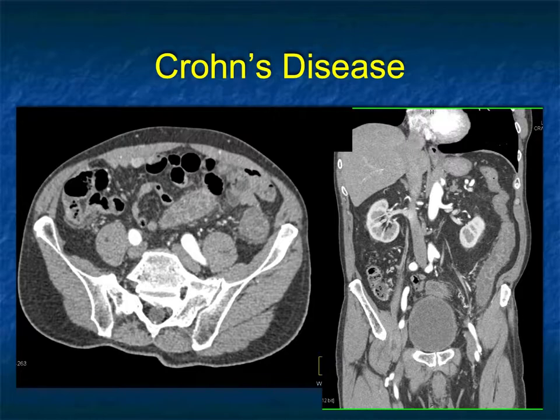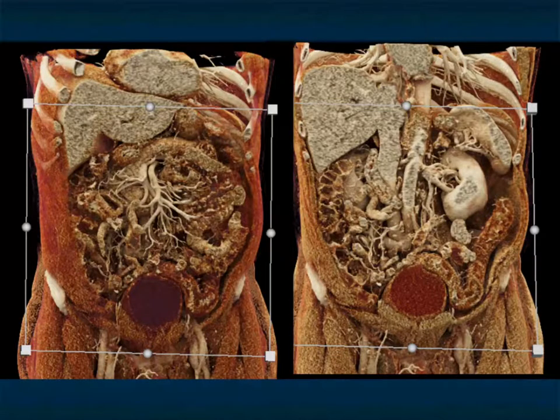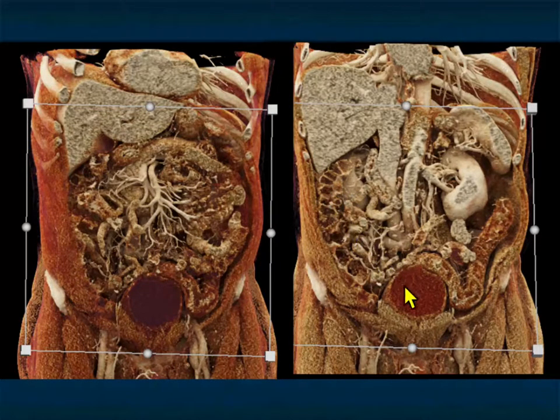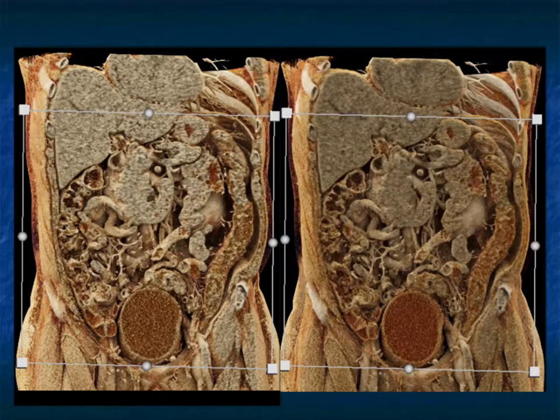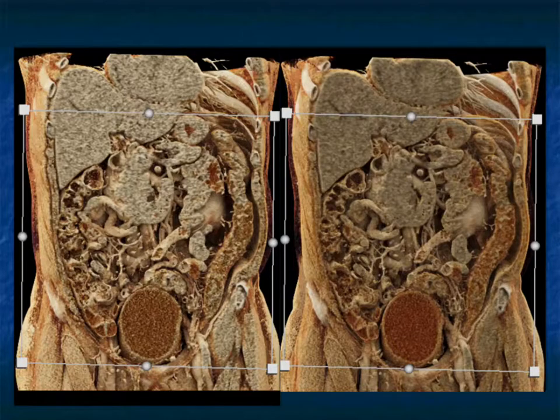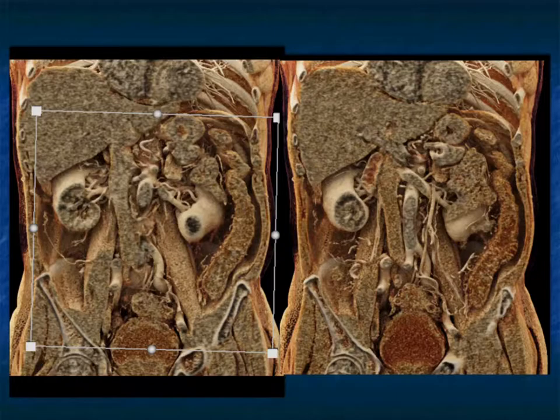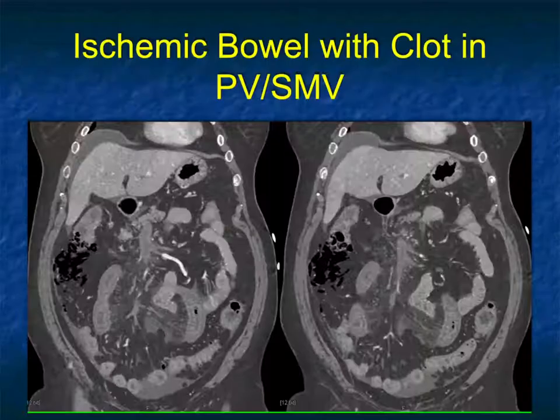Here's a patient with Crohn's disease — you see the thickened bowel, the thickening of the descending colon, the irregularity of the folds. As you track downward, look at those folds very nicely shown in the cinematic rendered views — look at the mesenteric vessels, look at the right colon. These are typical studies done with water as the contrast agent, but look how nicely you can see the edematous changes in the folds, particularly in the descending colon. By changing the rendering parameters, you can optimize that visualization.